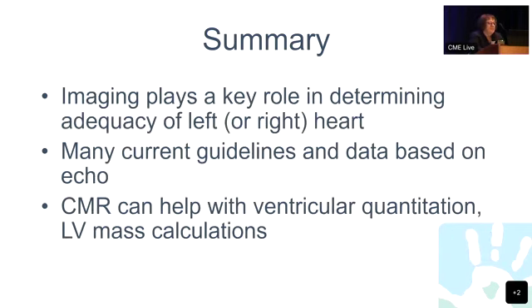Imaging certainly plays a key role in determining the adequacy of the left or the right heart. Many of our current guidelines and data are based on echo, so it obviously remains an important modality, but CMR can help with ventricular quantitation and LV mass calculations.